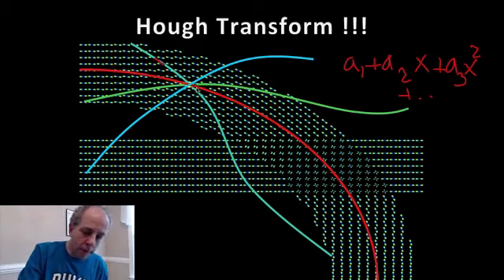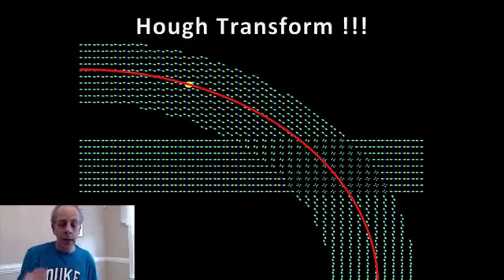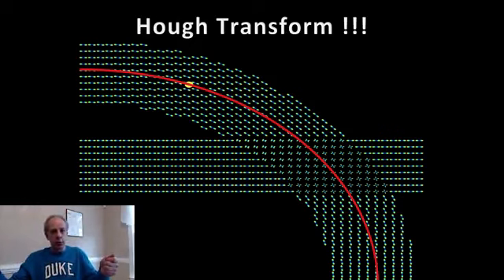So you go and vote and vote and vote. And then you take another one and you vote, and you pick the curve that has the maximal vote. So you say, this is the one where most of it, or at least the majority, or in a very strong case, the tangents go in the direction that the voxels tell me there is a high probability of going in that direction, a fiber or a cable, as we have been saying.